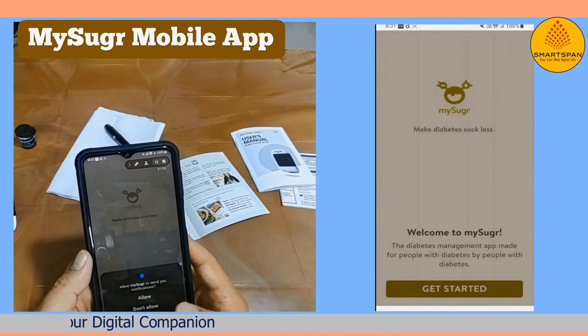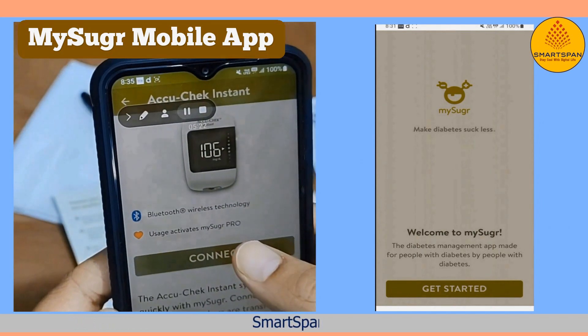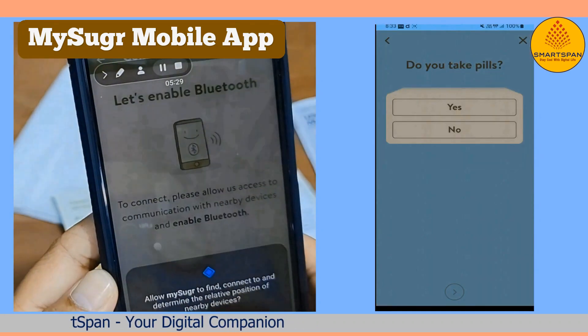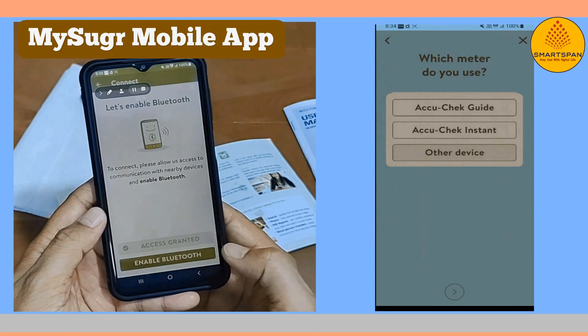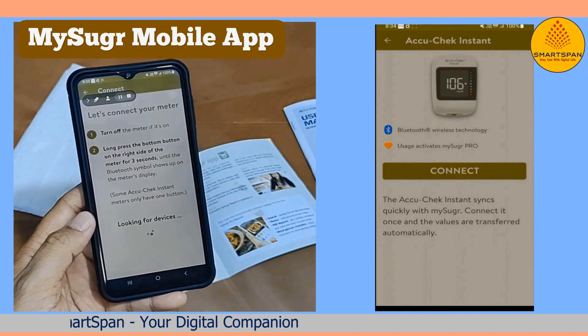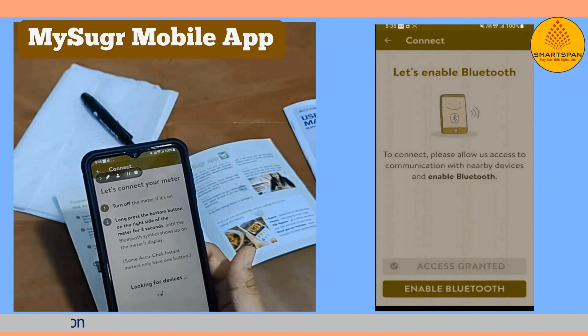The MySugar Mobile App is a powerful tool designed to simplify diabetes management and empower you on your health journey. It's a comprehensive solution right at your fingertips. With its glucose tracking feature, you can easily log your blood sugar readings, track trends, and visualize your progress over time. It also connects with AccuCheck Guide Meters to automatically sync data without manual logging.